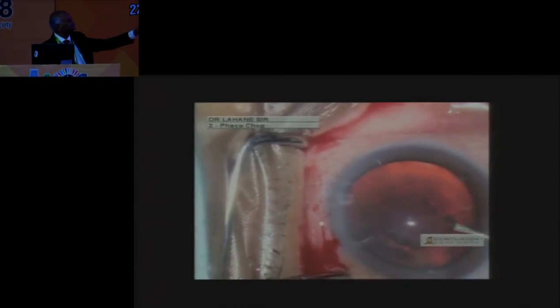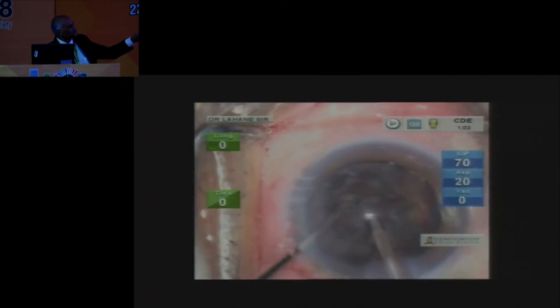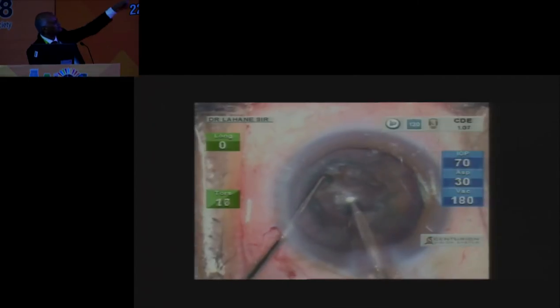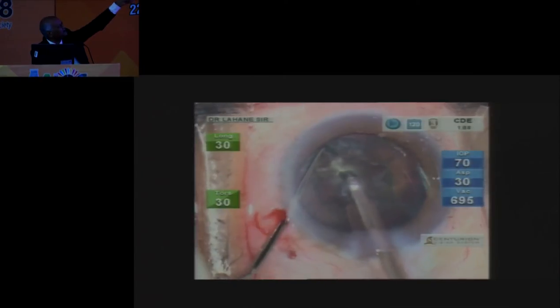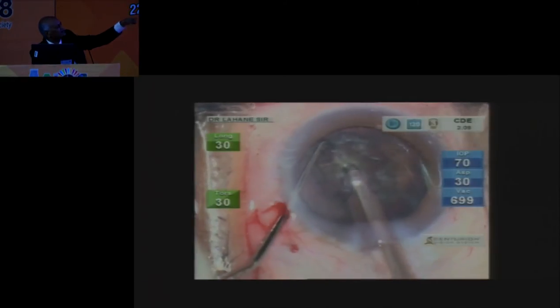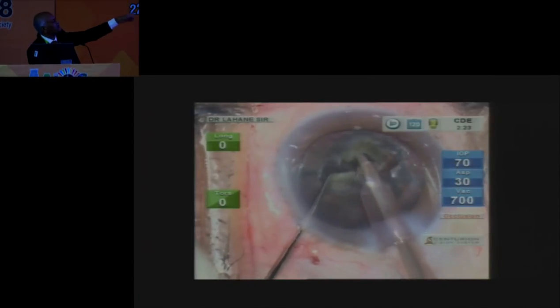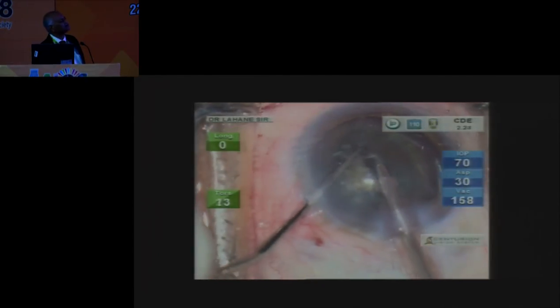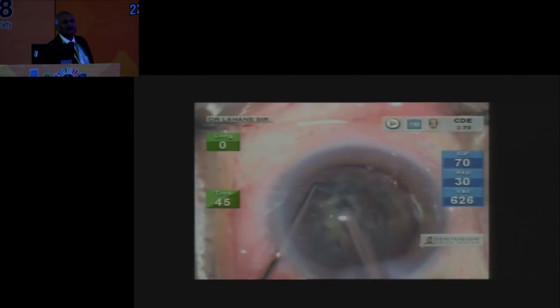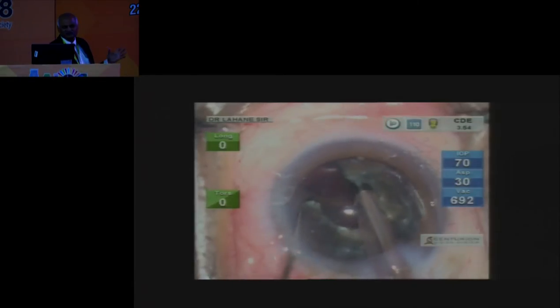Now I will just show you what IP is. See here, I am going in. You can look at the two places, 120 on the other side, you can see a light there. Once there is a light, longitudinal Phaco starts working. Again you see this is the indicator light, then longitudinal Phaco. It means once I occlude and the Ozil or torsional is not working, at that time if required the longitudinal Phaco works. If not required, longitudinal Phaco doesn't work.